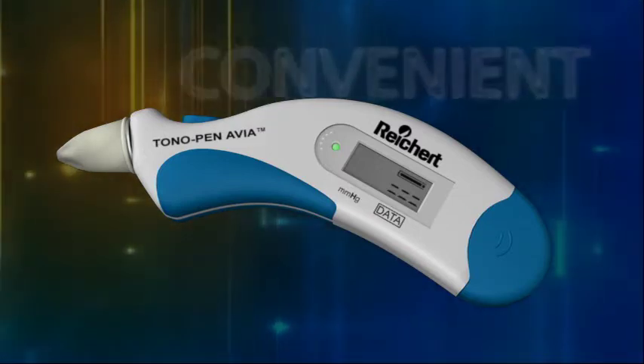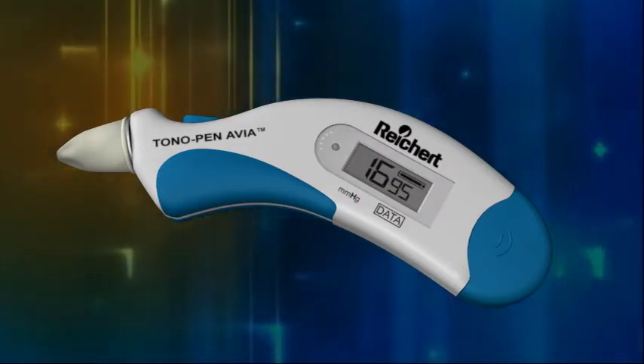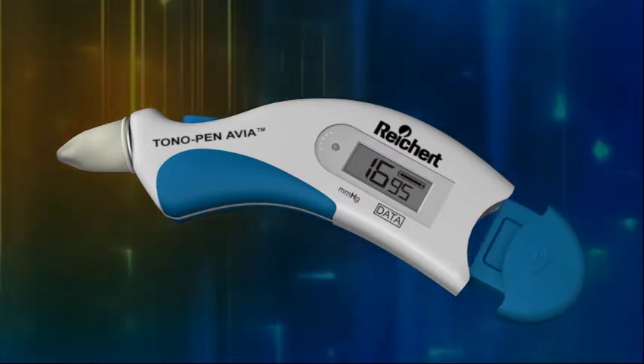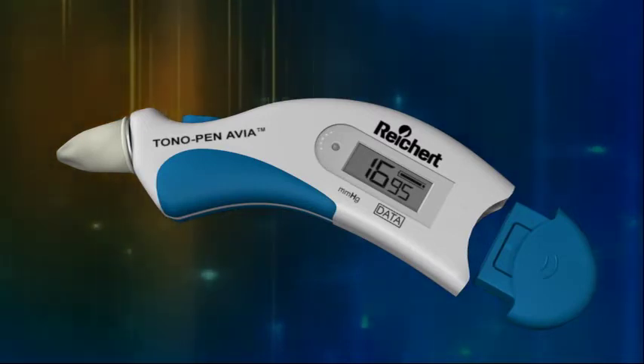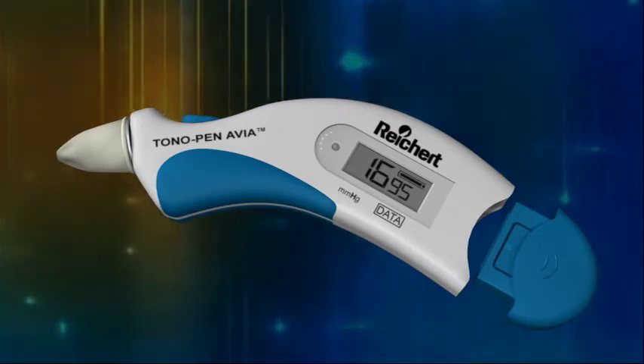The instrument is lightweight, convenient, and accurate. Its handheld design, compact size, and self-contained power source make it easy to use and a valuable tool for performing intraocular pressure screenings in the office as well as out of the office.